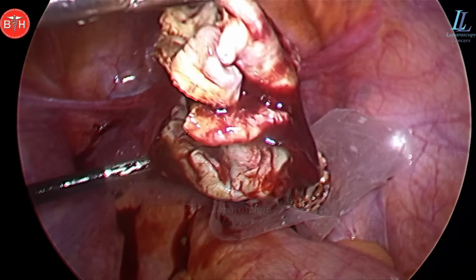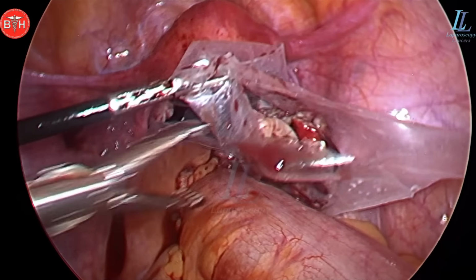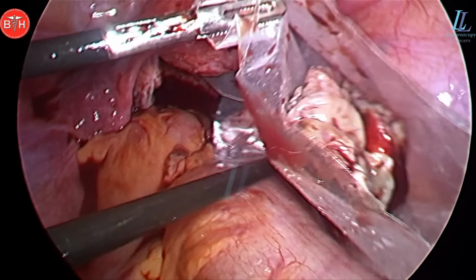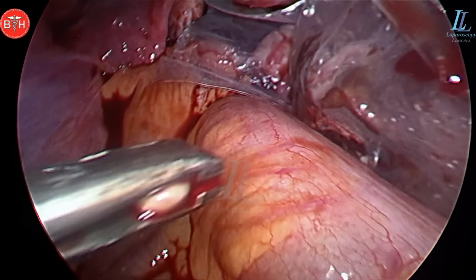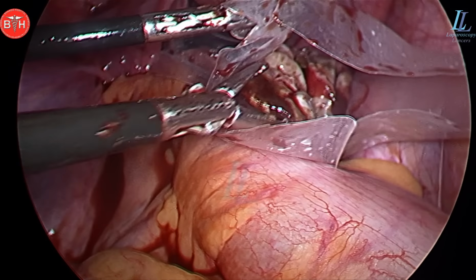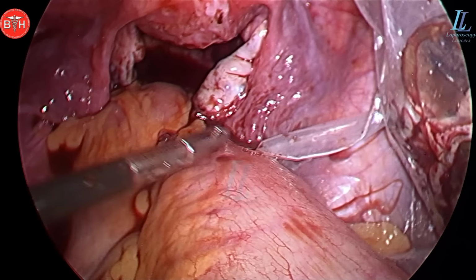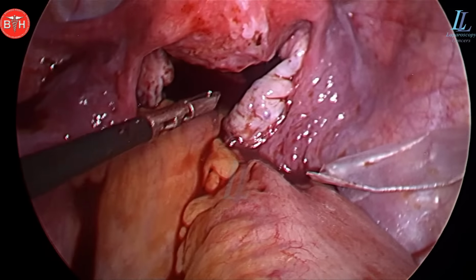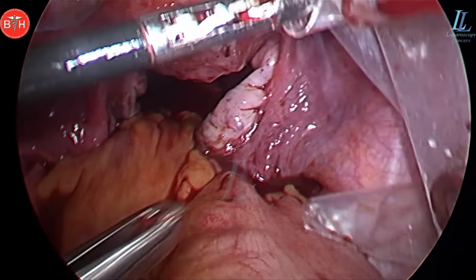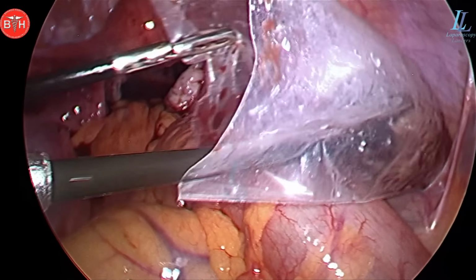We have sterilized it and put it in, and whole of the endometriotic tissue should come out with an endo bag, obviously, because there is chances of implantation of endometriotic tissues in the scar. So the patient should not have any scar endometriosis, and that's a very difficult and painful thing, a scar endometriosis. So please use an endo bag after thorough cleaning and suction. An improvised endo bag, obviously.